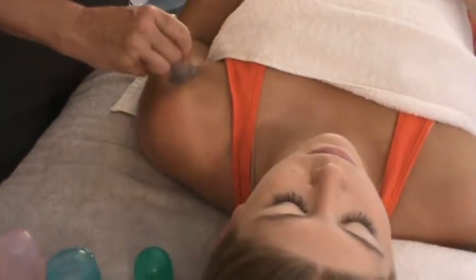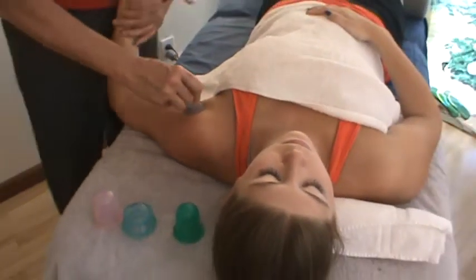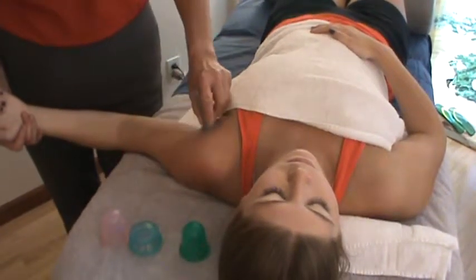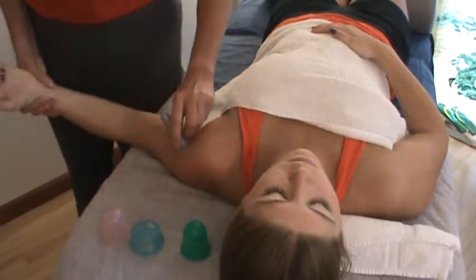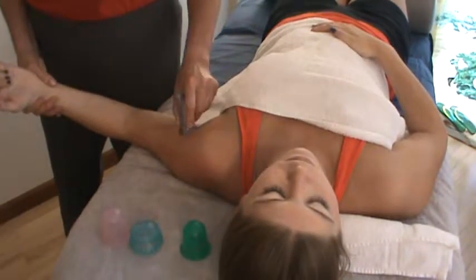Make sure you get into opening up the front of the shoulder, because that anterior axillary fold is usually the most common area of restriction and tension. You'll often feel some of the tight bands coming right across that anterior axillary fold. And the skin in many patients, especially if they've had chronic tension in their shoulder, the skin will even be tight.